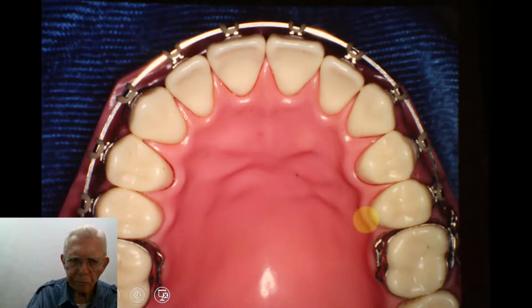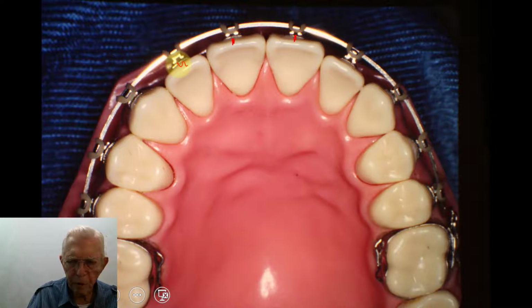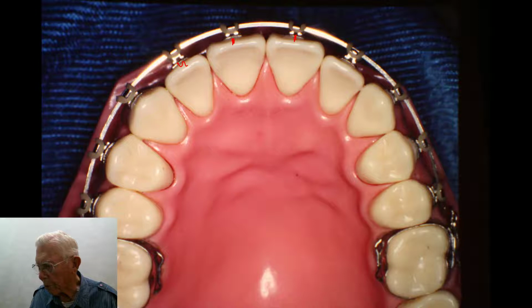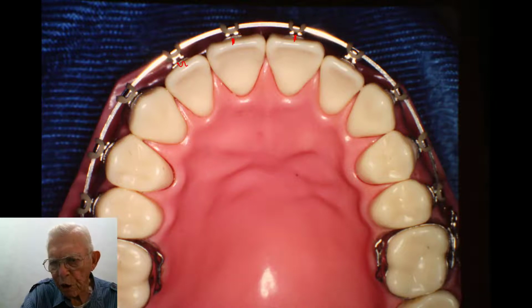Excuse me. Now, these brackets have little vertical slots in them, you see, right like that. Now, if you come to a spot where I'm going to have to pause this for a second, and let me get over here. Okay, we're back again. These have little vertical slots where you can put hooks, where you can put elastics in there.